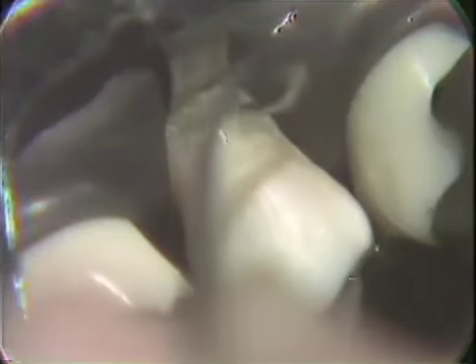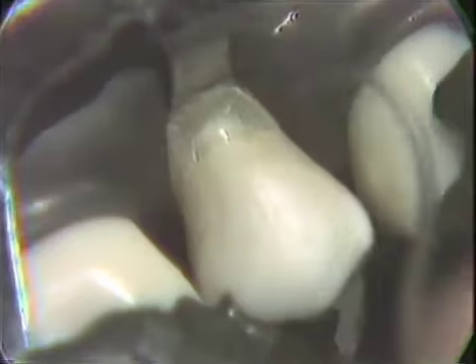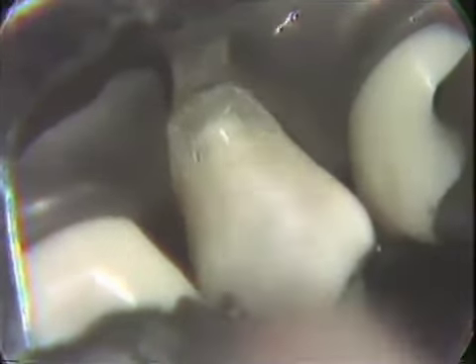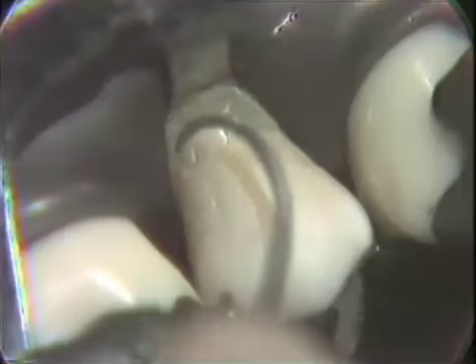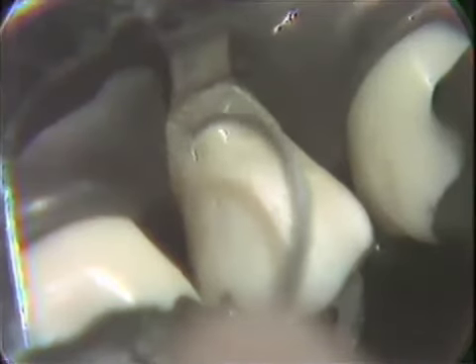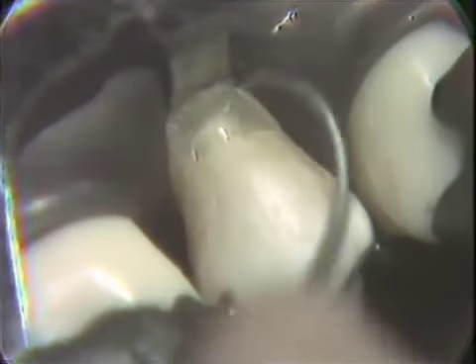The mesial wall, for example, is at a direction that is perpendicular to this outer surface. The distal wall likewise is perpendicular to the outer surface of the tooth. The occlusal wall essentially is perpendicular to that outer surface, and we've tested these walls with hand instruments to assure that there is a paralleling of enamel rods. In the cervical area, we're into cementum. Again, we're merely forming essentially a perpendicular margin at that position.